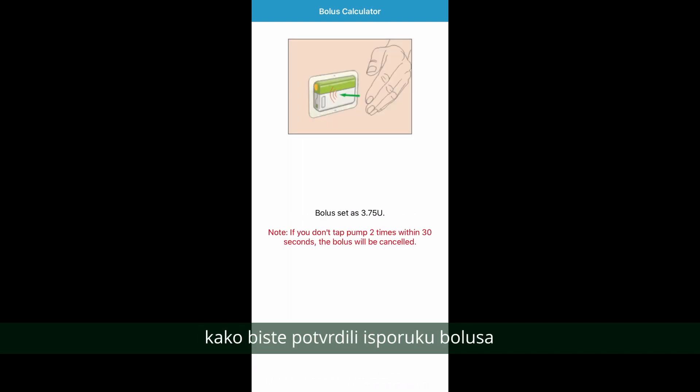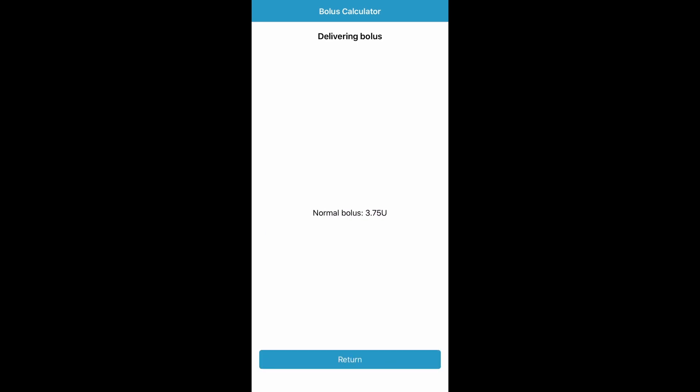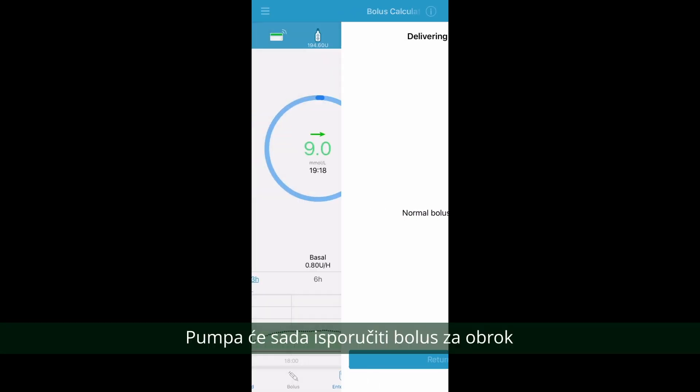Remember to tap on the pump twice to confirm delivery of the bolus. The pump will now deliver your food bolus.